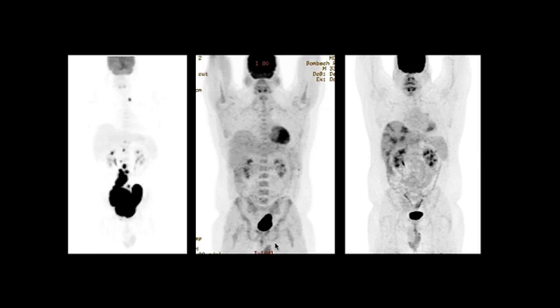The patient comes back for a follow-up, and on the subsequent whole body image on the right we see heterogeneous areas of hypermetabolism involving the entire liver. They're not focal and not very intense in FDG activity, but certainly are concerning for lymphoma or some other process.